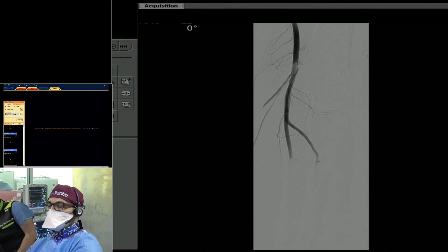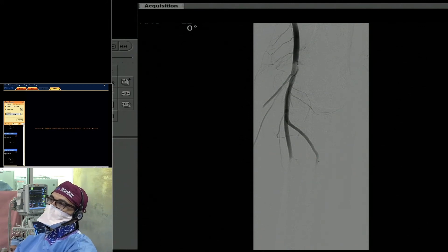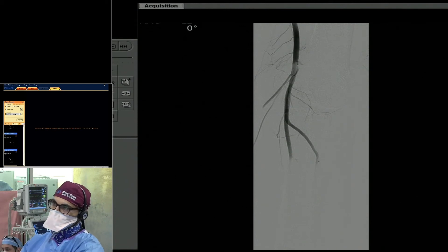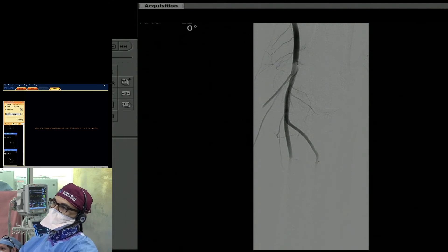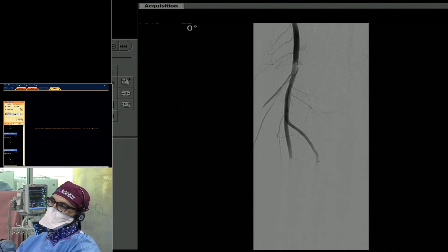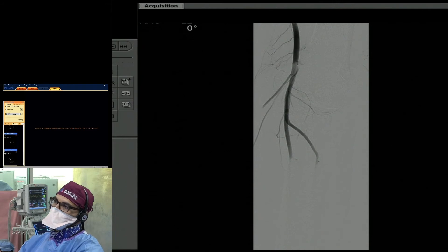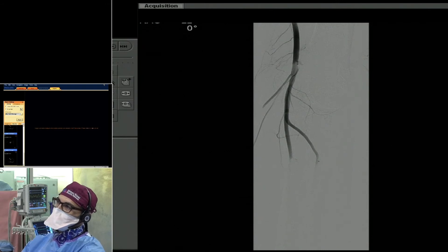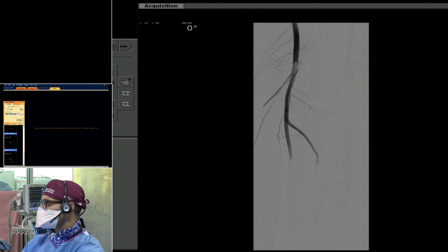Regarding which balloons we're going to use, there are two main options I like in the SFA. I would consider using the Metacross from Terumo, which is nice — it's long, a 200-centimeter-length rapid exchange — versus a Pacific Plus balloon from Medtronic. Since we've already crossed with a 0.035 wire, I'll go ahead and predilate with a 4-millimeter Metacross, then potentially go with a 5-millimeter. It doesn't look like a very big SFA, so maybe just 5 millimeters to start, see what it looks like, and then decide whether to stent or not.